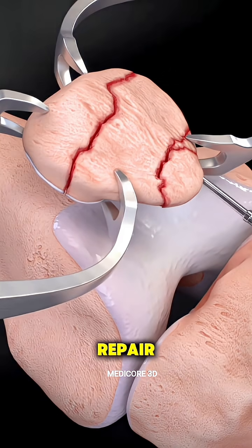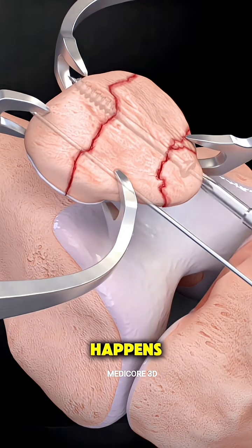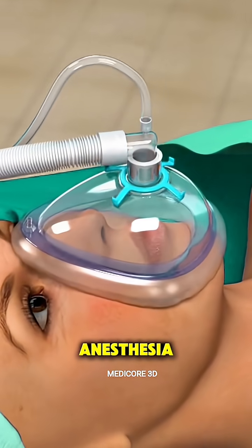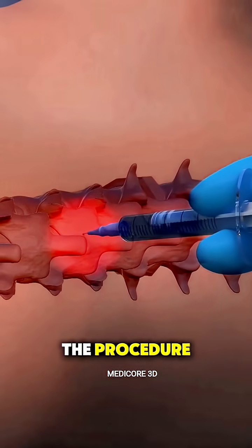Ever wonder how a patella fracture repair surgery is performed? Here's what actually happens. First, you're given anesthesia, either general or spinal, so you won't feel anything during the procedure.